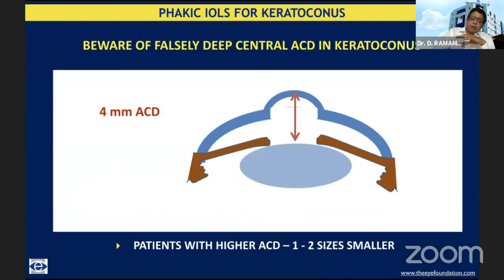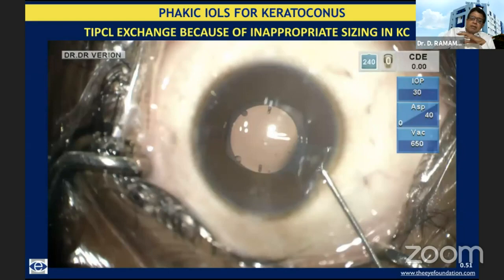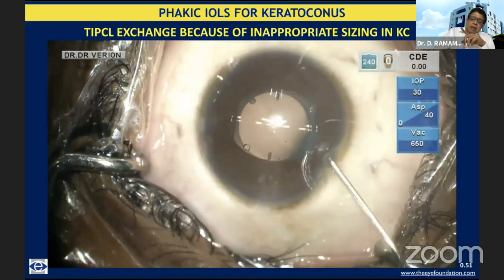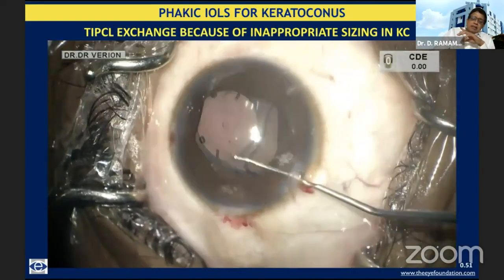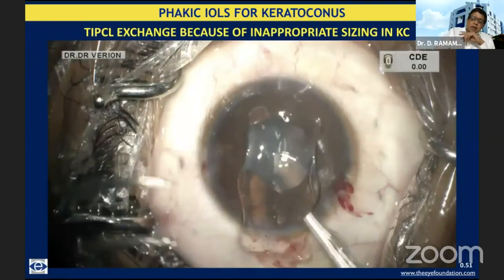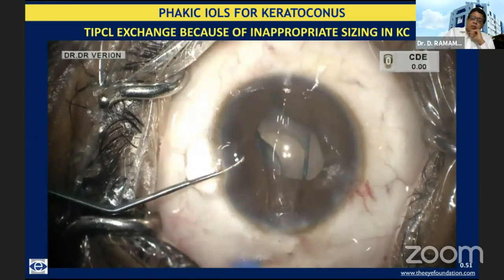In a normal cornea, you get a straightforward reading, but when you have a patient with central keratoconus, you might get a fallacious reading as far as AC depth is concerned. There might be quite a bit of crowding in the periphery — and we burnt our hands initially. This is a patient where a couple of times we tried to reposition the lens; basically it was a sort of optic capture where the edge of the lens was coming forward. Subsequently, we realized these lenses have to be made slightly smaller. This is actually a lens exchange being performed, and the iris atrophy you're seeing is because of a couple of attempts at repositioning. The same lens design was implanted, but in a smaller size.